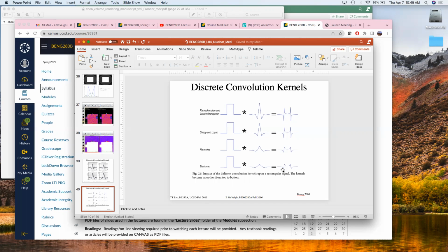But it is the most fundamental thing to know about CT, SPECT, and PET. Because for all of those imaging techniques, what you do in the end is reorganize your data so that it is in parallel bins, and then you perform this. Even if your data is shot out in all weird directions, you collect it on your computer, reorganize it into parallel bins, and then do the reconstruction.